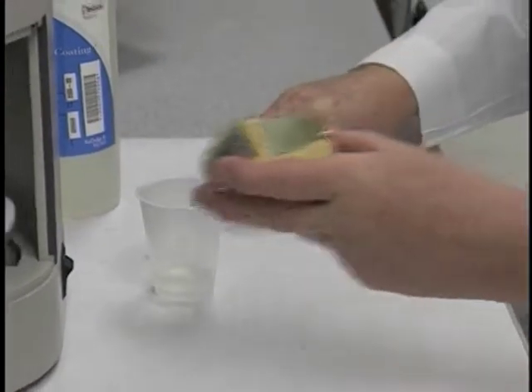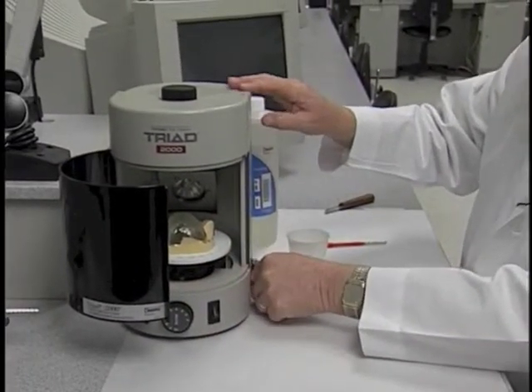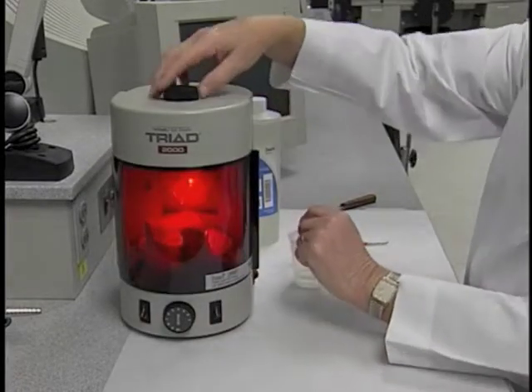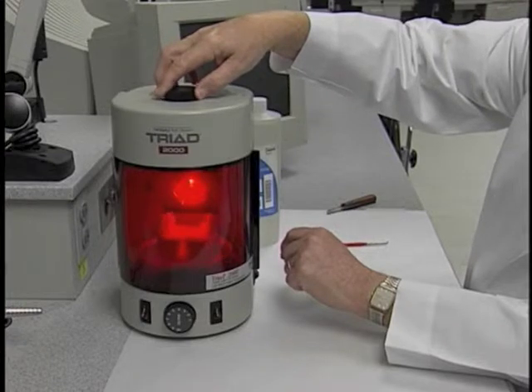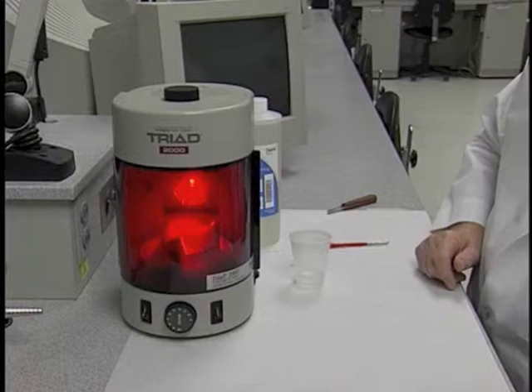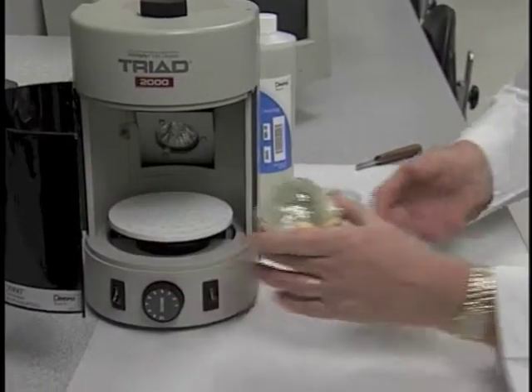And then we place it into the oven. This time I want to lower it back down now until we're getting a maximum concentration onto the tray from the light, and allow that to cure for 4 minutes.